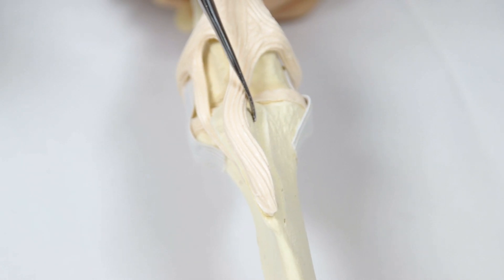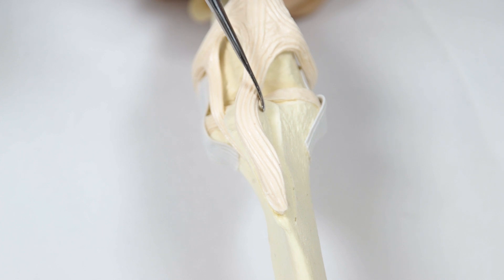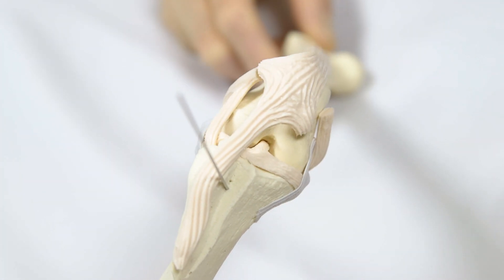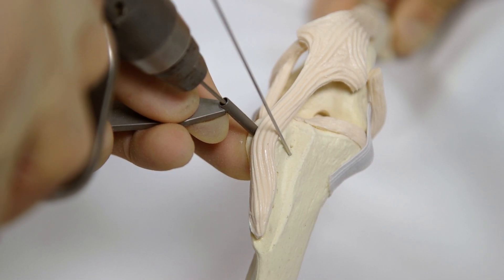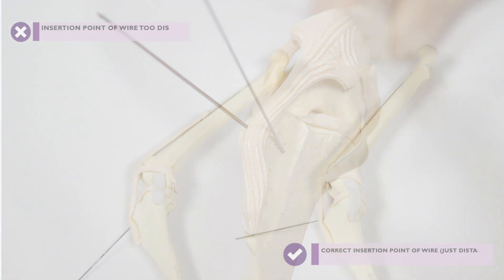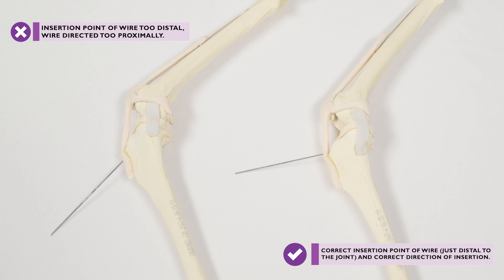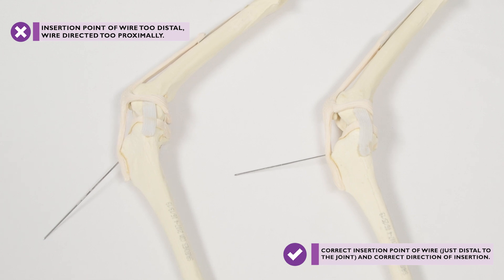Using a periosteal elevator, the tibial tuberosity is gently and carefully transposed laterally into a position that achieves neutral orientation of the quadriceps mechanism and reliable tracking of the patella through full range of stifle movement. Two arthrodesis wires are driven into the proximal tibial tuberosity to immobilise it in its new laterally transposed position. Positioning for the arthrodesis wires should be just proximal to the distal insertion point of the patellar ligament to avoid creation of a stress riser. They should be directed slightly craniolateral to caudomedial and away from the stifle joint.